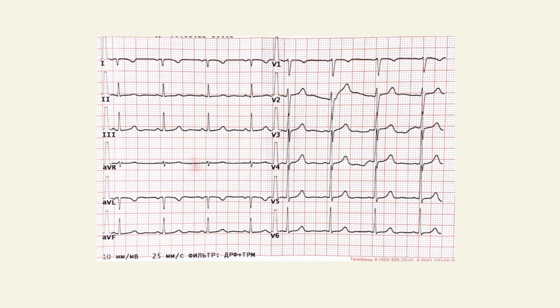Look at the QRS complex at the limb leads. We can see right axis deviation. Look at the QRS complex at lead 1 — in a normal situation we would expect a different complex. This is an ECG of a young woman, and this is not a normal complex.